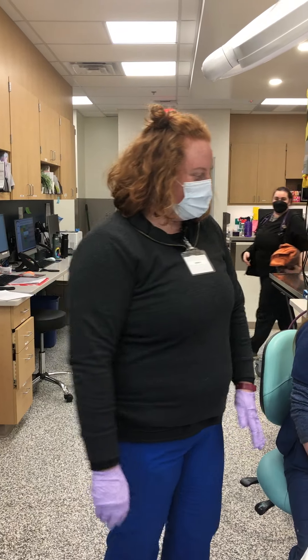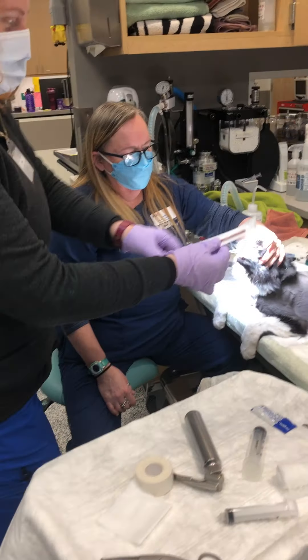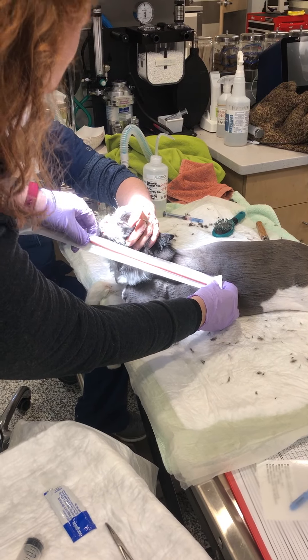Hello, I'm going to be placing an oral gastric tube on this feline patient today. First I'm going to measure the stomach — see where the last rib is, right there to the canine tooth.